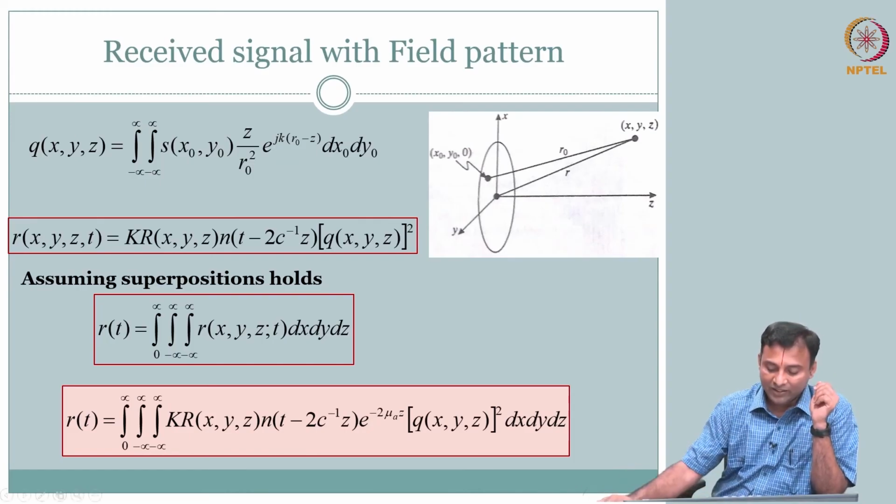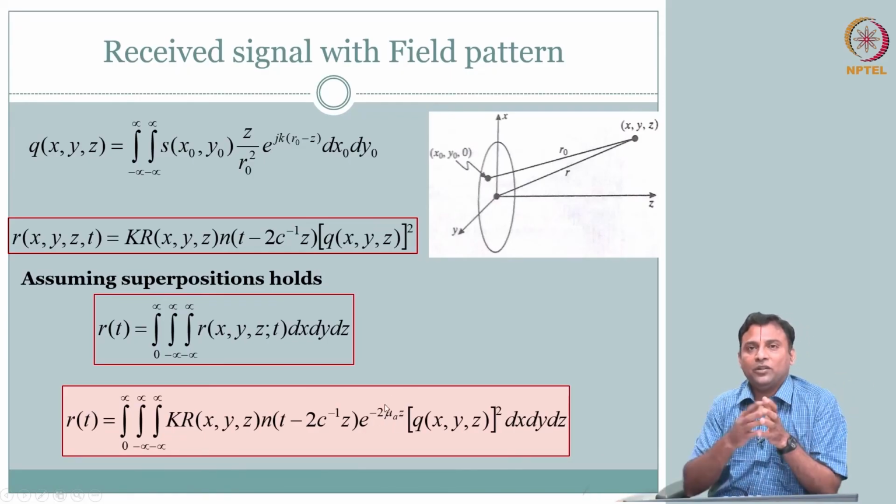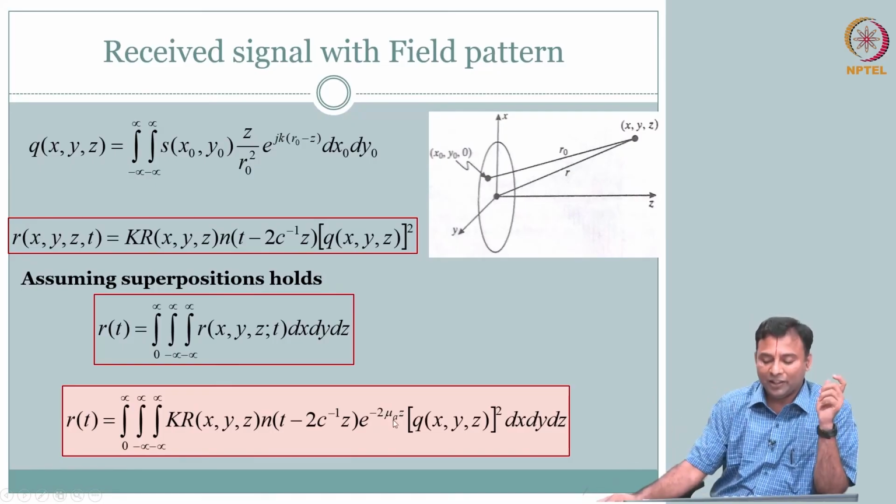Okay, so that is a catch, very important, tricky. I will highlight that again as we go, how we use this for measurements and so on. Okay, but that is the reason for introducing this conveniently. So the echo is going, the echo is coming. Let's also include the attenuation there.